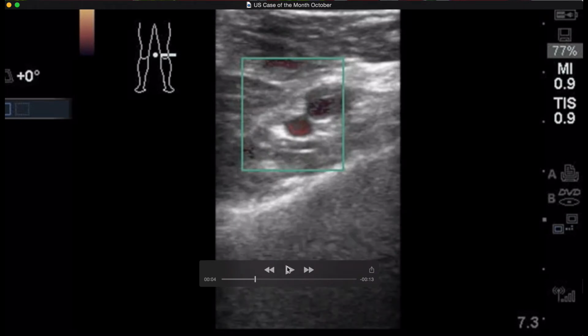Next, the ultrasound performed a color evaluation. So they put color flow on the vein, and you can see on the outside of the lumen where the clot is that there's no flow through that region. Well, it's okay to put color flow on.